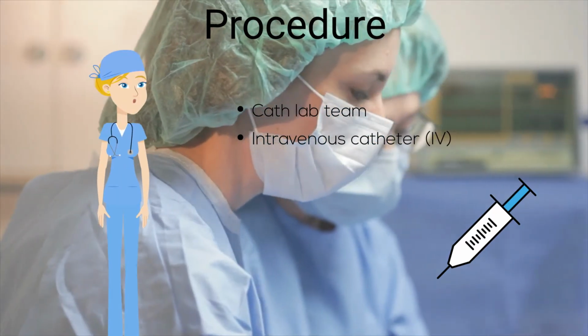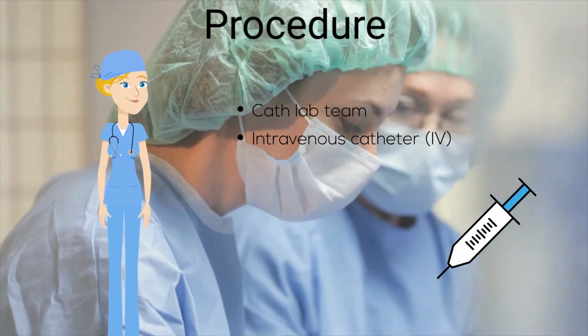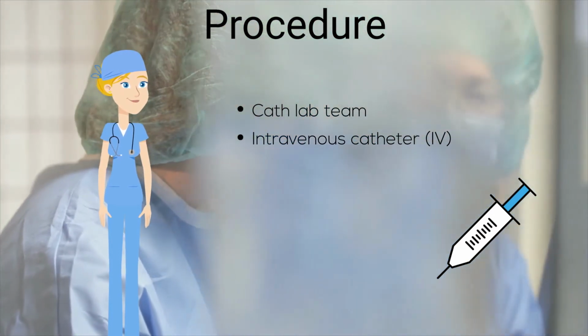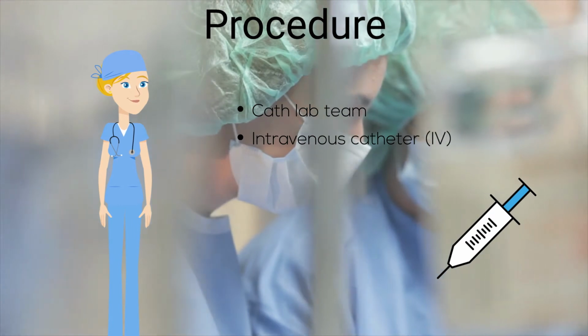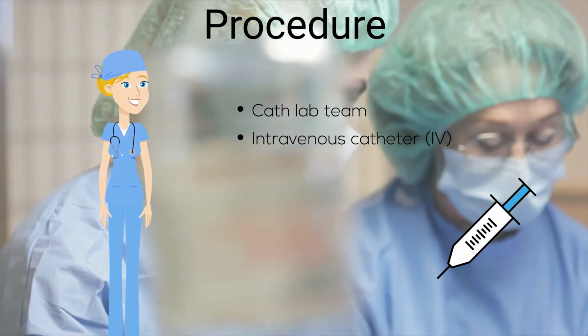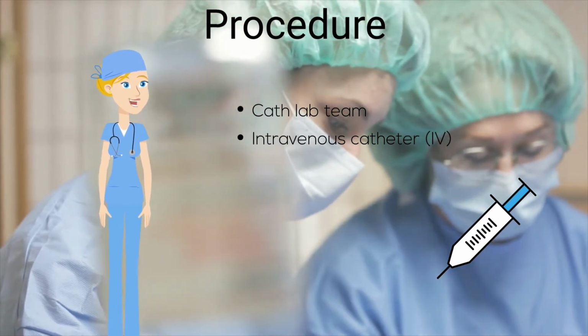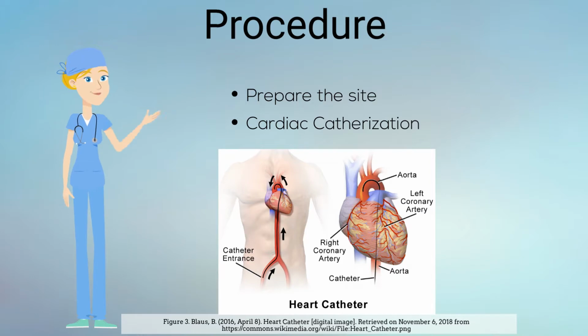On the day of a catheterization, there will be a team of doctors, nurses, and technicians that will help you throughout the procedure. Prior to starting the procedure, an intravenous catheter, or IV, will be inserted to administer medication during your catheterization. This medication will help you feel relaxed but remain awake throughout the procedure. Once at the catheterization lab, medication will be administered to keep you comfortable.